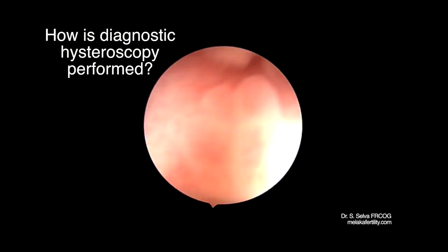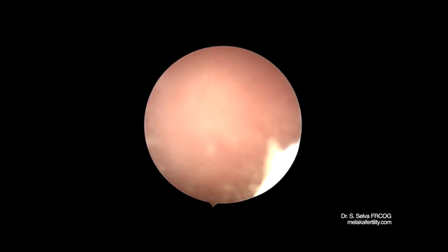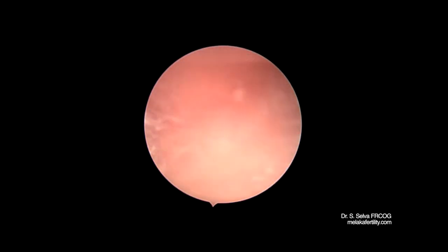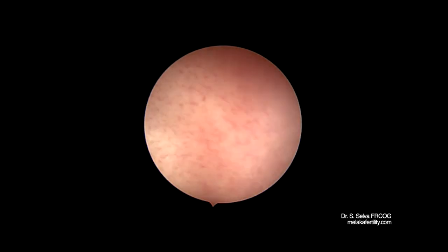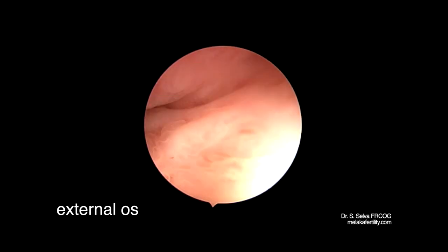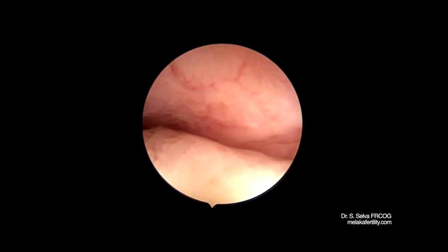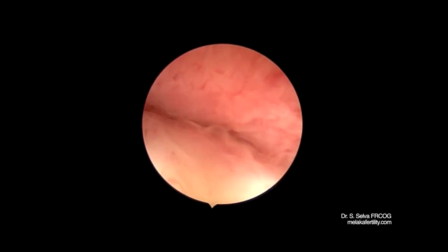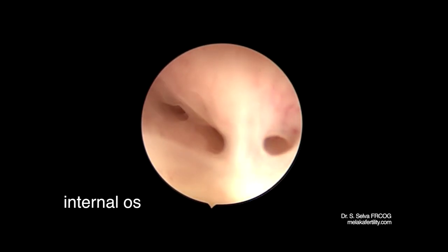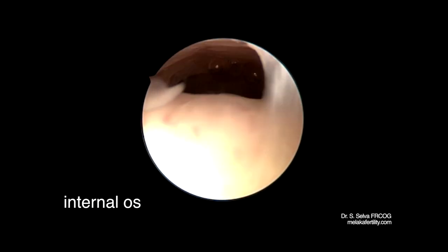This video shows how a diagnostic hysteroscopy is performed. Saline is used to distend the endometrial cavity. The vagina is distended with saline and visualized. This is the cervix. This is the external os. The hysteroscope is passed into the external os. This is the internal os. There are some adhesions at the internal os. The hysteroscope is passed through the internal os.